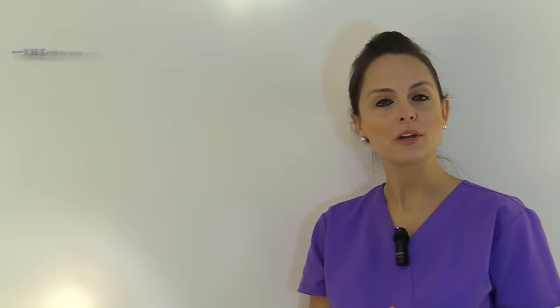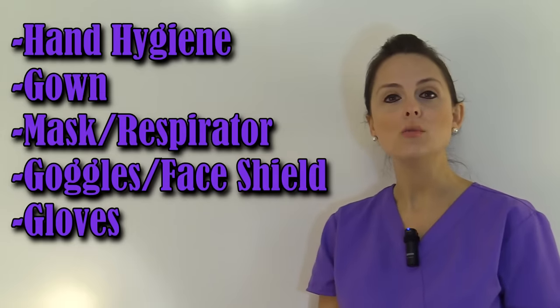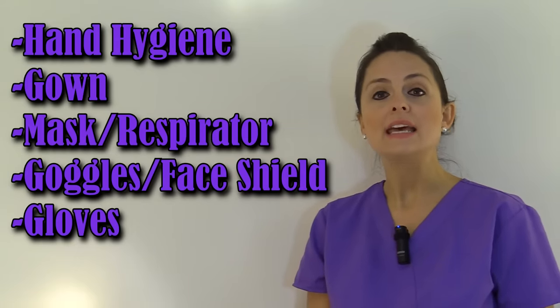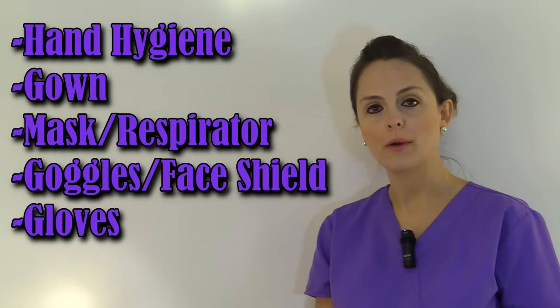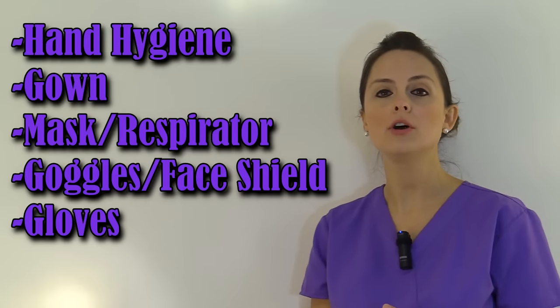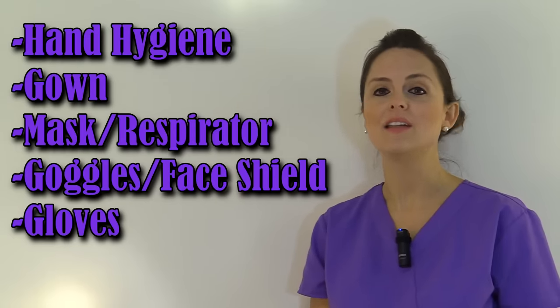Now let's talk about the sequence of how you would don or put on PPE. The first thing you want to do is perform hand hygiene. Then you will put on the gown, then the mask or respirator depending on which one you're going to wear, then the goggles or face shield, and then lastly the gloves.